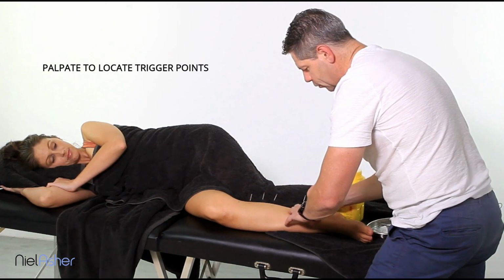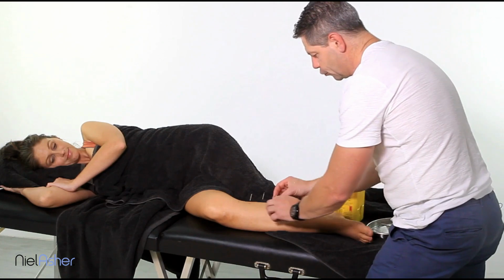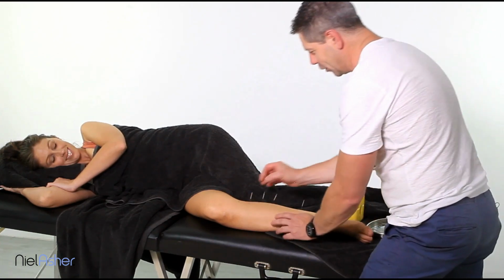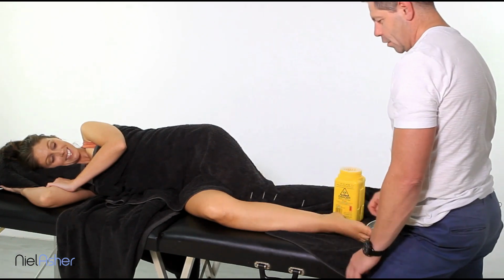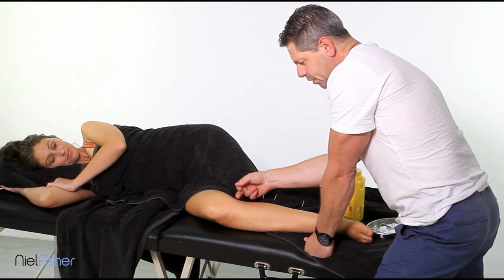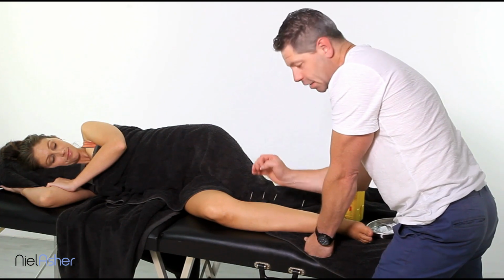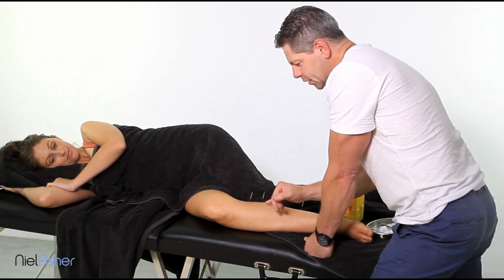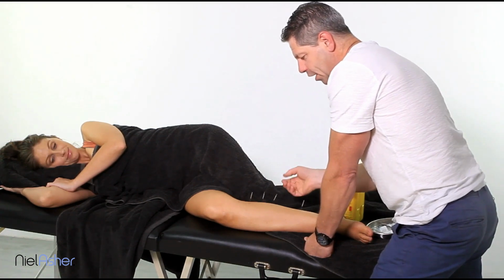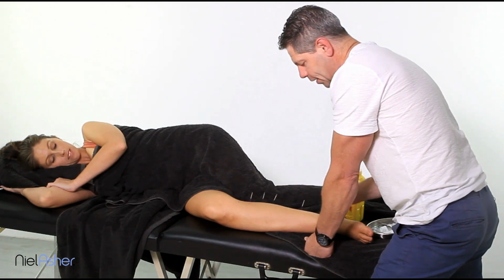Now, remember, sometimes these trigger points can be very powerful. So it's really important that you check in with your clients just to see how they're feeling. There's a really strong Popliteus there. So once again, tibia condyle, come down, which is roughly around about here. We're about 2 finger widths in, posterior to the tibia, needle in. Same with tib post, so go down, roll off the tibia, palpate deep. So you're going to be pushing the gastro out of the way. Once again, the same with flexor dig and then the soleus.